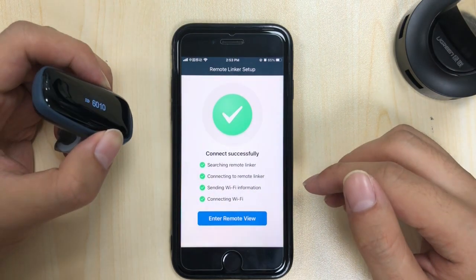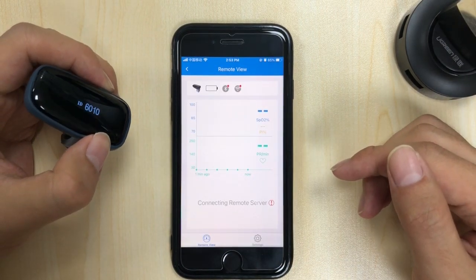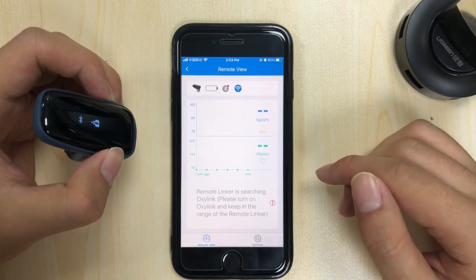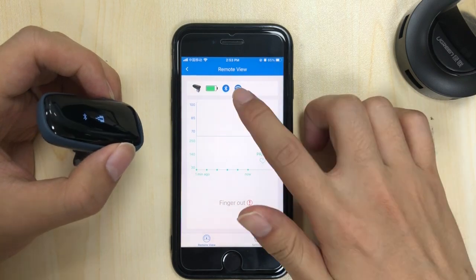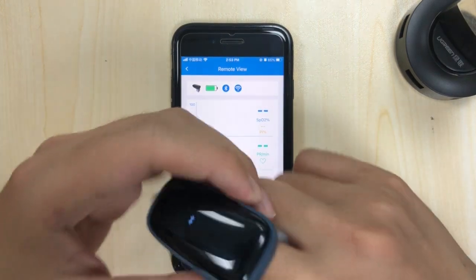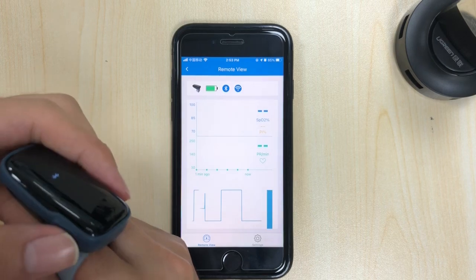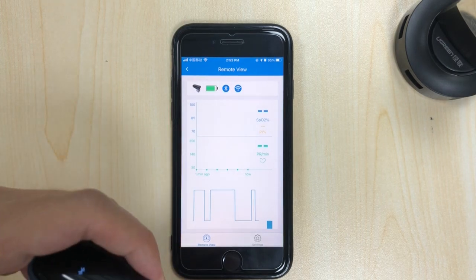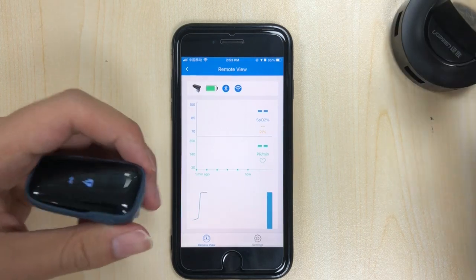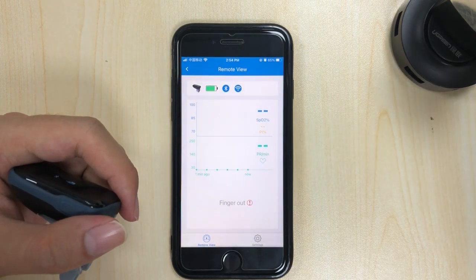They're both online now. The OSLINK is currently connected via Bluetooth to the Remote USB, and then the data goes from the USB out to the internet and comes back down here.